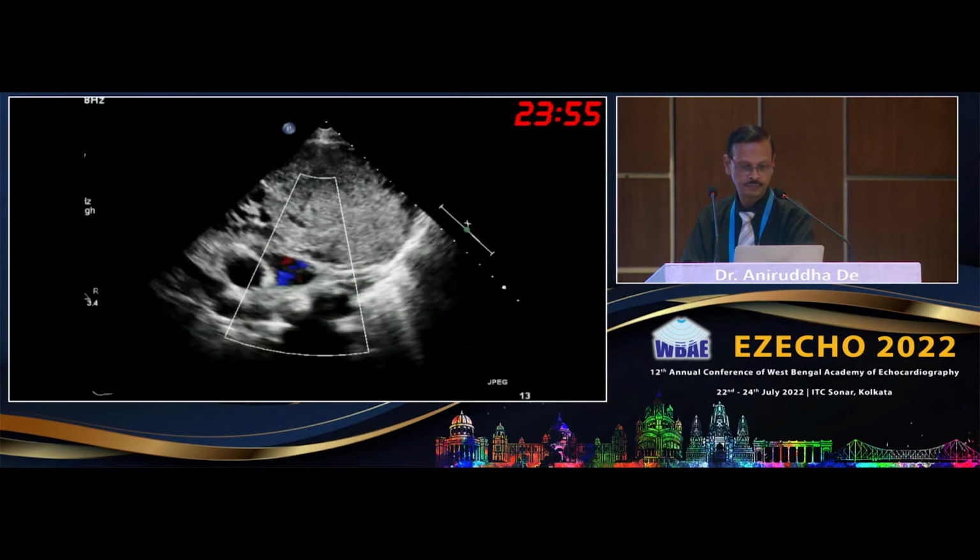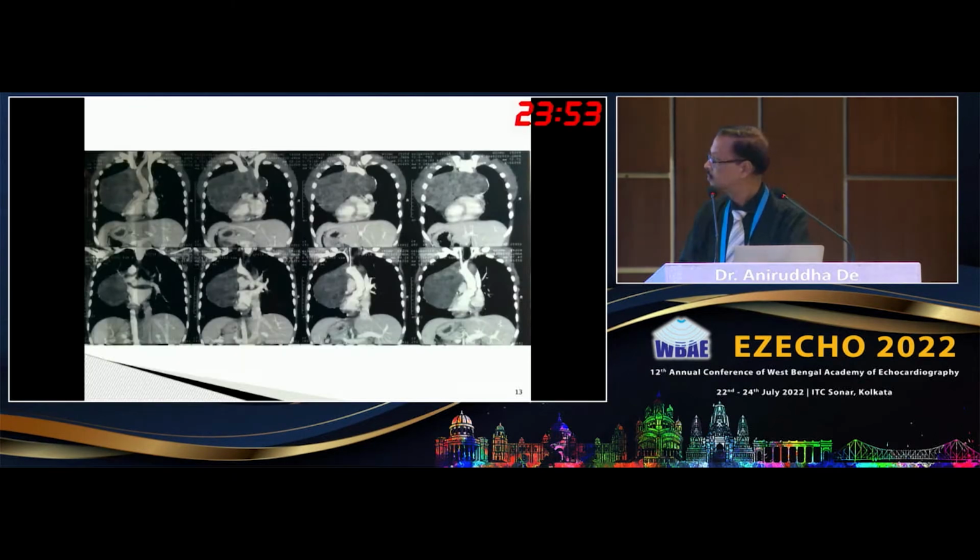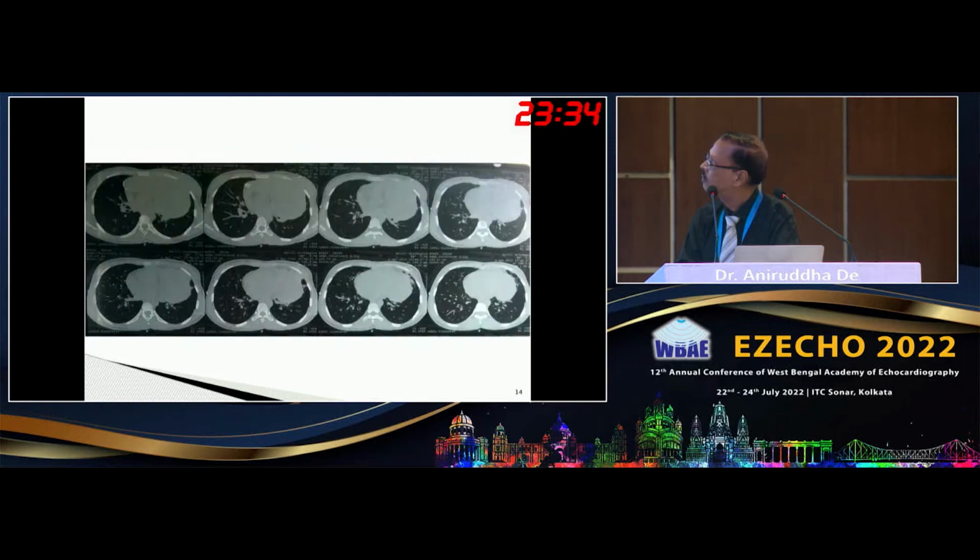Yeah, basically anterior mediastinal masses, we have this. Seeing the findings, you can tell the audience what you are getting. So there's a large solid mass with multiple necrotic areas, lobulated. If you need more slides, I'll change it. And it's not enhancing. Next one, this is one.